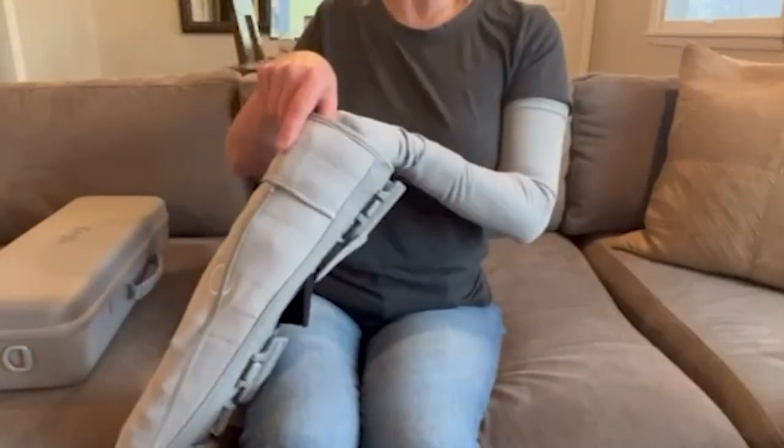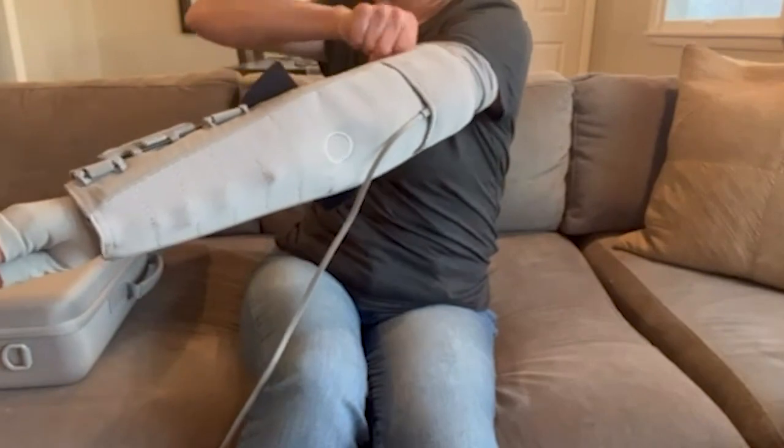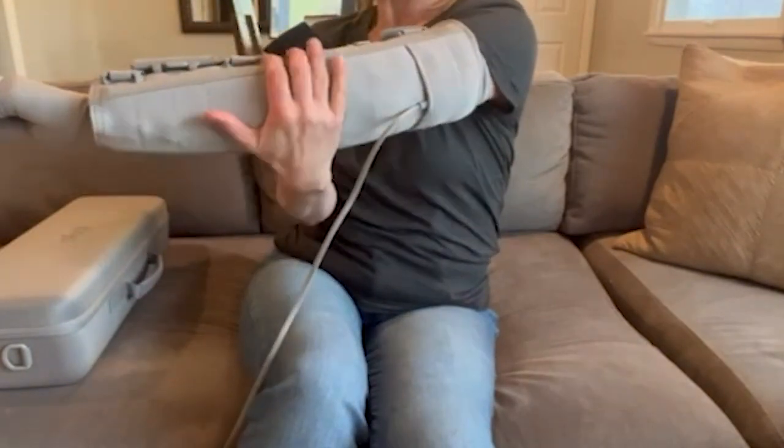With the smaller end of the cone facing away from you, slide your arm through the cone. The garment should cover your arm completely.